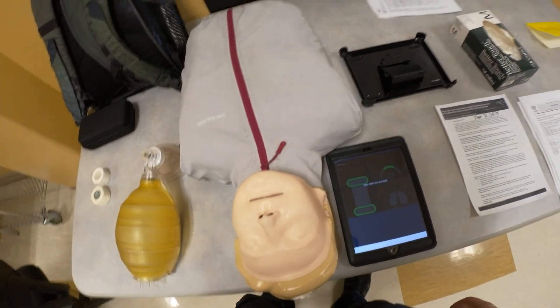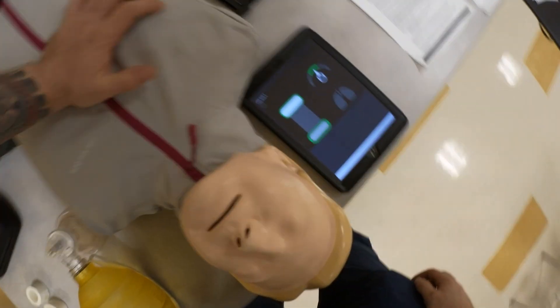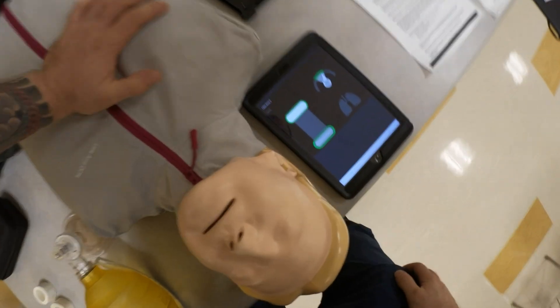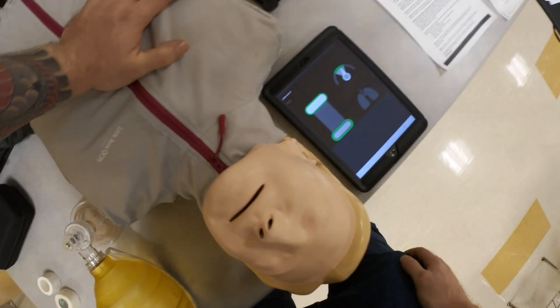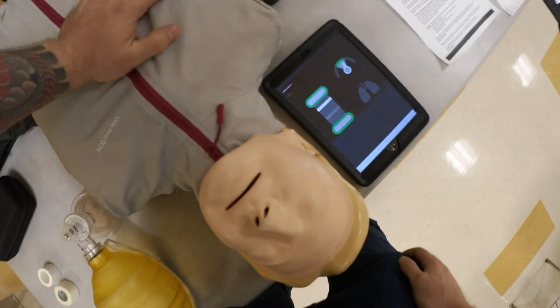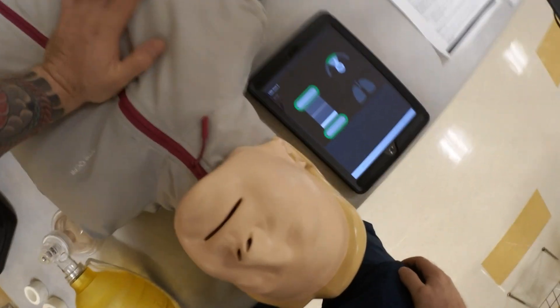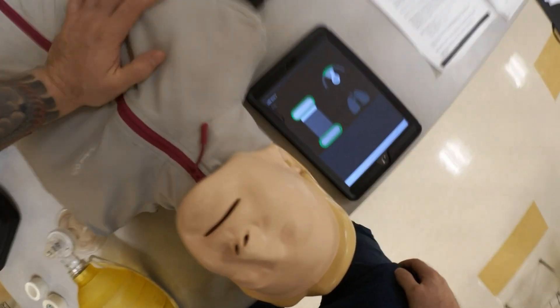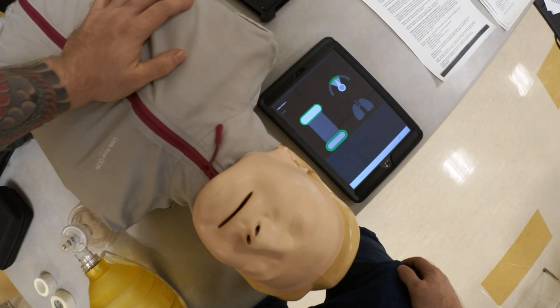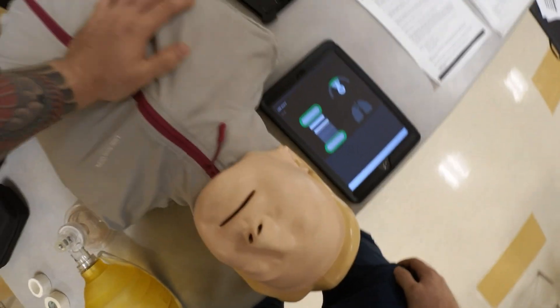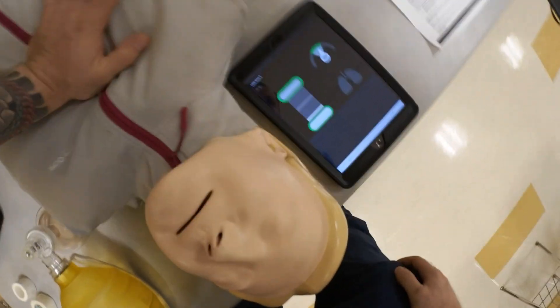We're going to go ahead and commence with our compressions — counting through 30 compressions in the first cycle, followed by ventilations.